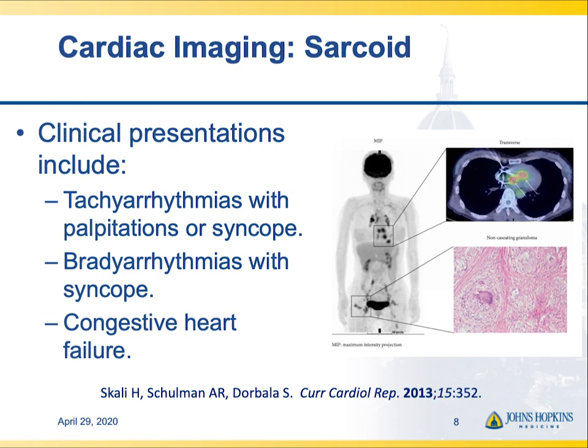Here we're going to do exactly the opposite in terms of patient preparation as we would with viability. We're going to put the patients on an all-fat diet for at least 24 hours before the start of the scan. We don't want them to really have any carbohydrates on board. In diabetic patients, this can be a challenging protocol to pull off. But if we do it right, by depriving the myocardium of glucose, it switches over to a fatty acid-based metabolism.